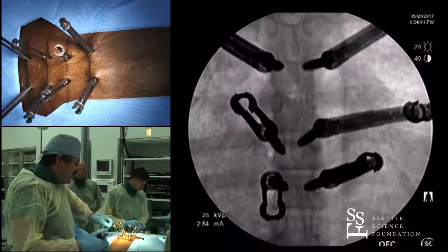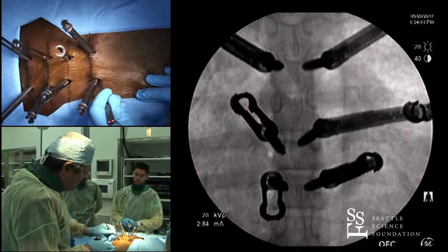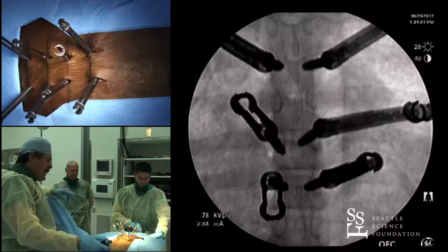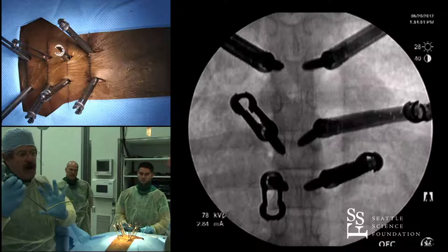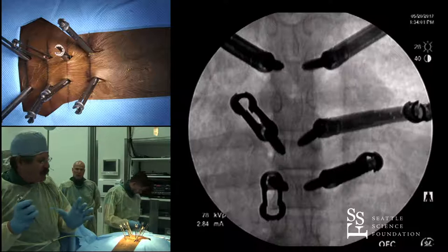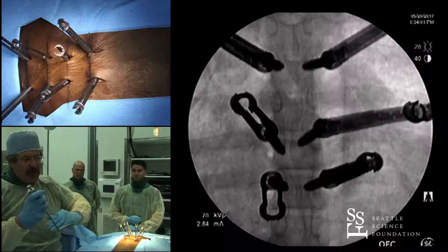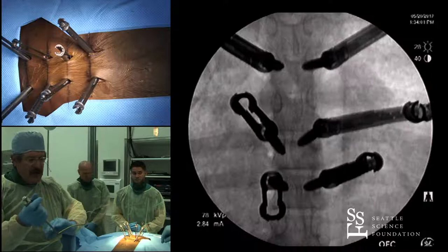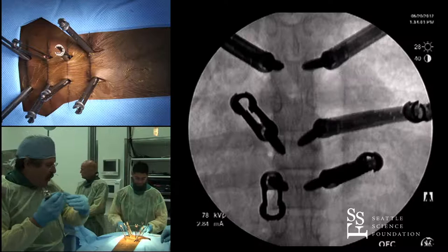Once those are in, we'll do our rod pass. I intentionally don't make my holes any bigger than needed until I'm ready. I usually look at the patient and decide whether to pass caudal to cephalad or cephalad to caudal. If you have an ankylosing spondylitis patient, you really want to contour your rod to match their kyphosis — some are very hyper-kyphotic and that can be very challenging. In an ankylosed spine, if you don't match their kyphosis just right, you'll try to pull screws up to the rod and because there's no motion between vertebrae, you'll rip the screw out.